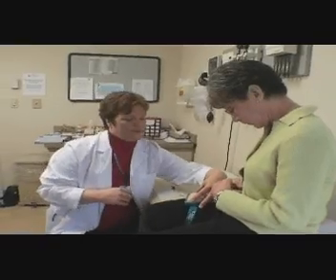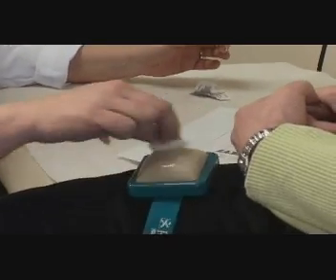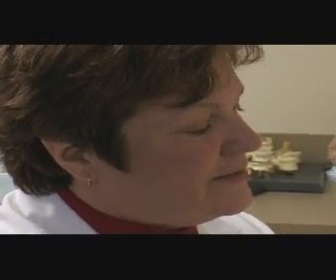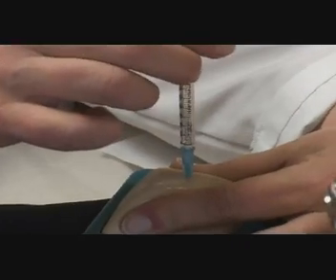So now, if this was your leg, you're going to squeeze and inject. You can clean your site with alcohol, and I always wipe it because alcohol stings and it does irritate if it gets into the blood. Your medicine comes in 1 cc, so you're going to be filling that syringe. These needles are a little longer — my demonstration needle. Insert, squeeze, straight out. Do not try to pull it at an angle or rip it away, because if you drag it across your skin, this is very sharp and it will cut you. So you got to be real careful with that.